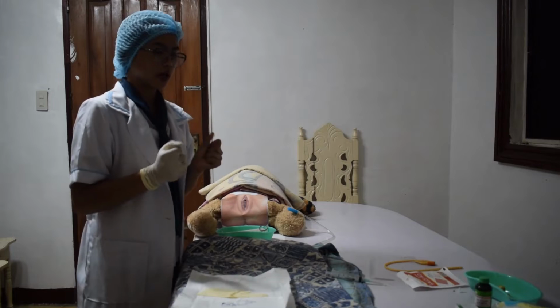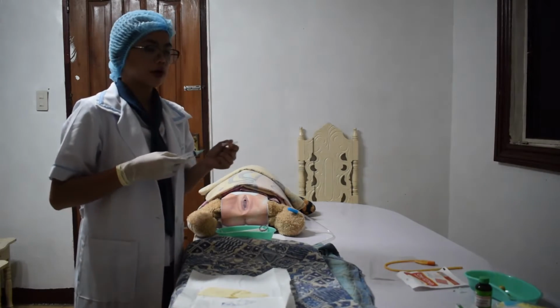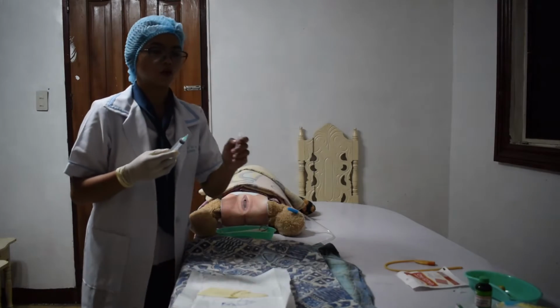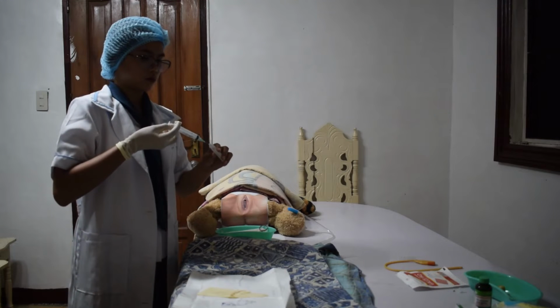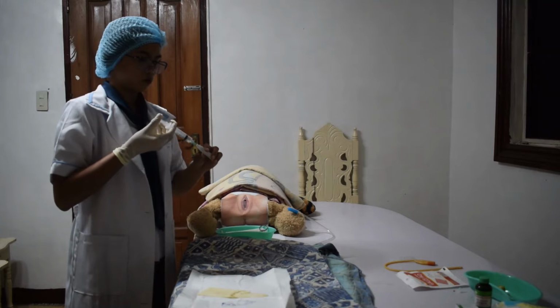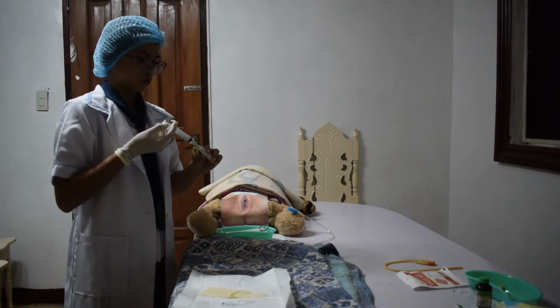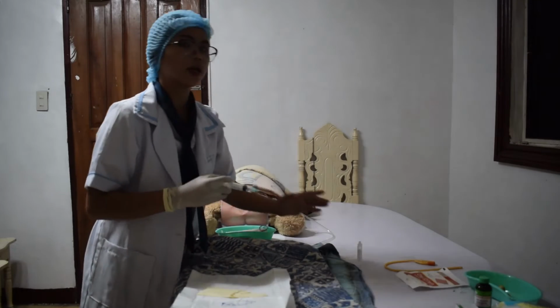The gloved hand picks up the sterile syringe and fills it with sterile water, while the ungloved non-dominant hand holds the bottle of sterile water. And then wear the second glove.